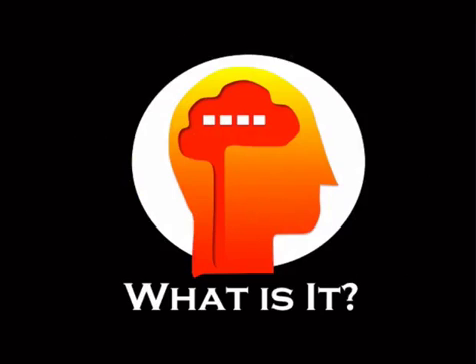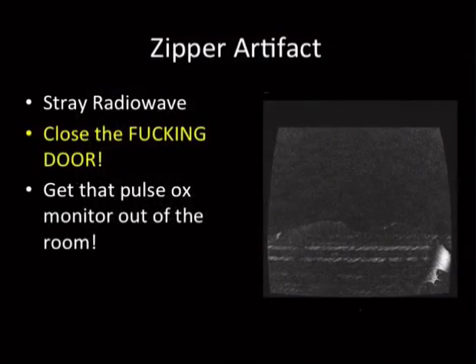All right, next artifact. See these lines here sort of running across here? This is a so-called zipper artifact. So remember that your RF pulses are basically radio waves. So if you've got a stray radio wave moving through there, you can end up with these zippers of high signal, like 1 to 2 pixels running across the image, typically in the phase encoding direction.